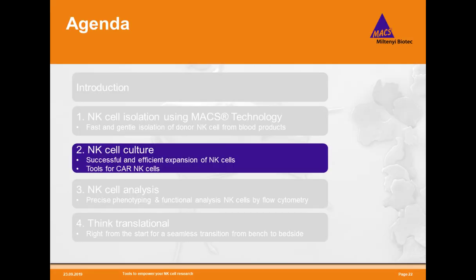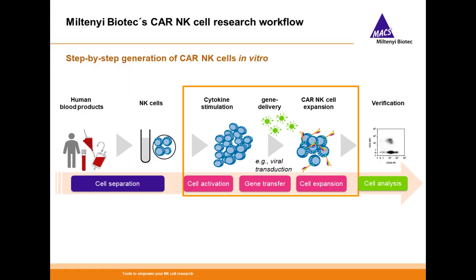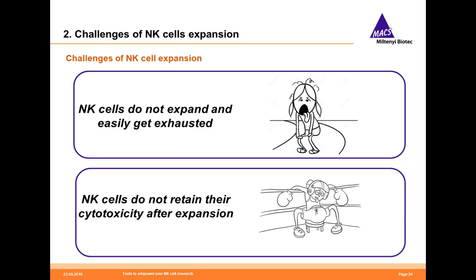Okay, now let's continue to the other great challenge of culturing NK cells. In the workflow, I will show you just as an example, I have written down here step-by-step generation of CAR NK cells, but this workflow can be used with or without the CAR. So in general, if you are going to culture NK cells, this is very useful information for you.